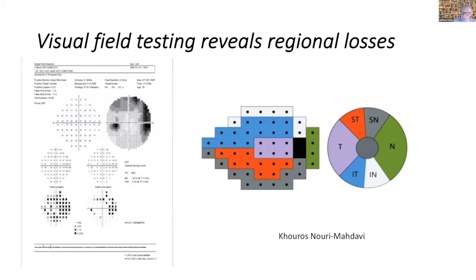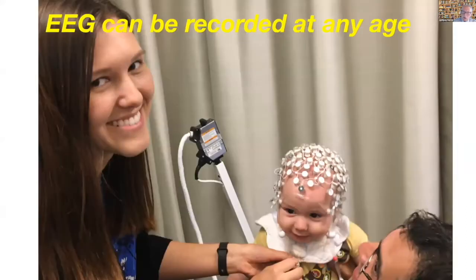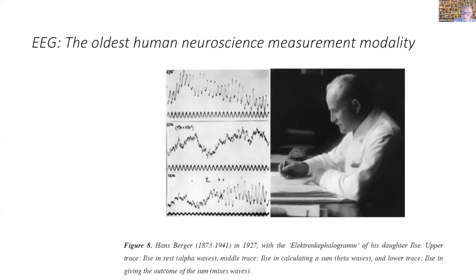And so we're trying to move towards this with an objective measurement based on EEG. The nice thing about EEG is that it is a direct neural estimate, and it's objective. Also, it can be done in children of any age. This will be particularly useful for apples to apples comparisons that we heard Shannon talk about, and longitudinal studies.